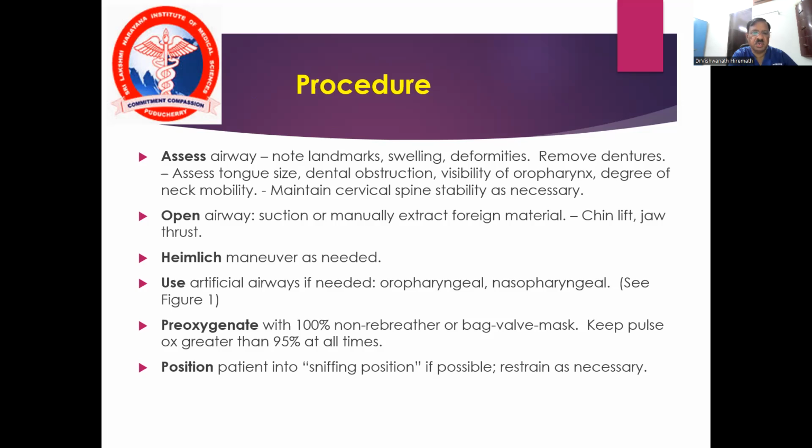Always pre-oxygenate with 100% oxygen, non-rebreathing or bag valve mask. Pulse oximeter should be attached, and SpO2 should always be maintained above 95%.